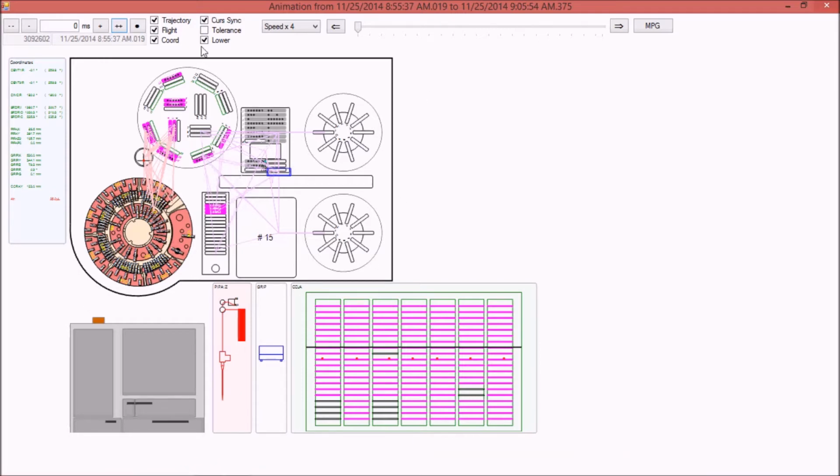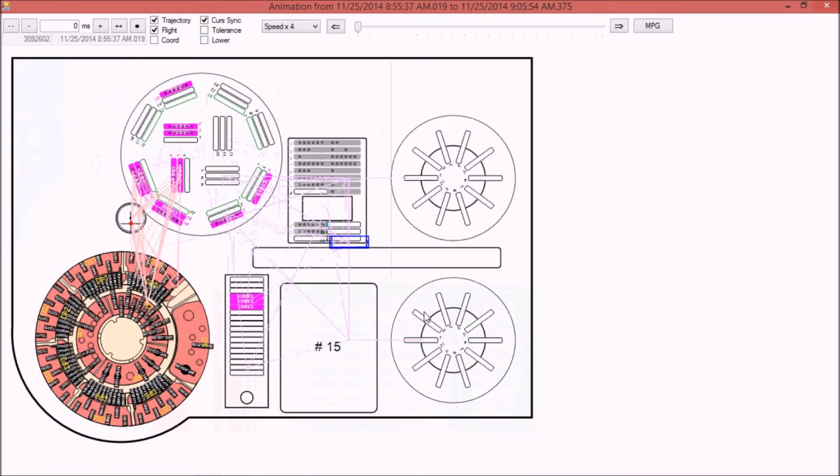It is possible to tailor all this information contained in a changeable way in order to improve the user experience. For instance, it's possible to increase the plan of the instrument itself. What you see here, all this, let's call it nest, is actually the trajectory that the different subsystems, in this case we have two moving arms, walk through during the selected period. This is what we get when we start with a simulation itself.